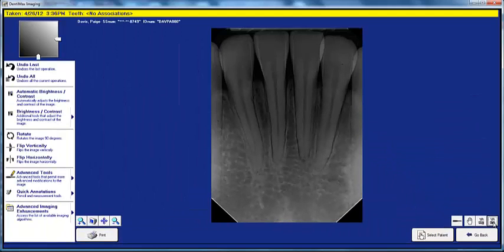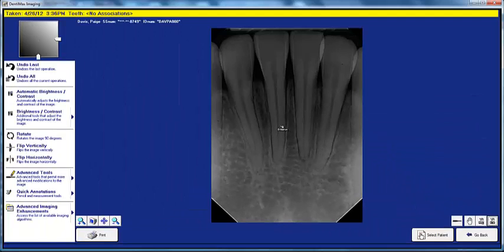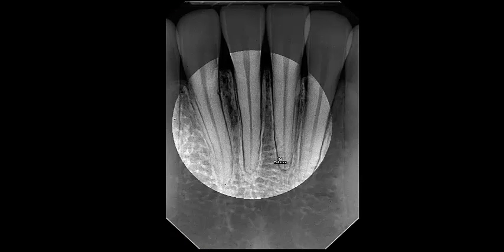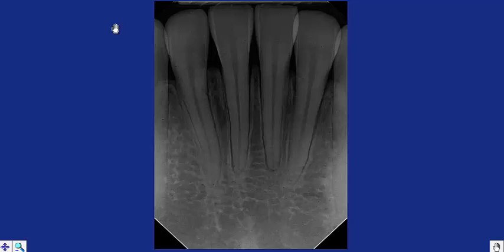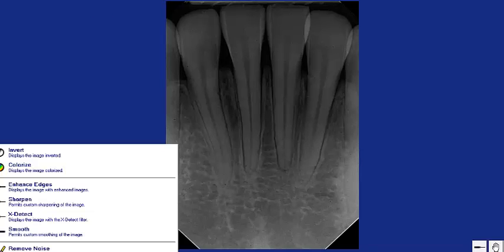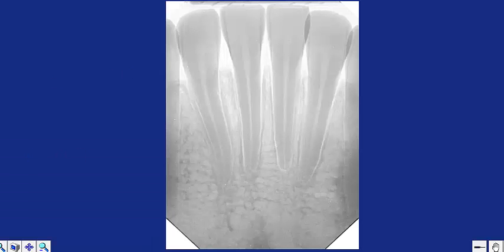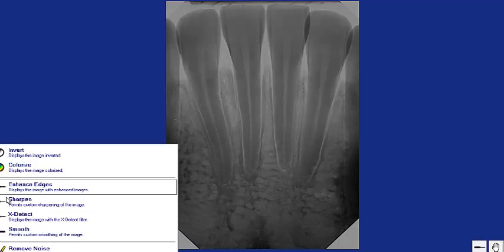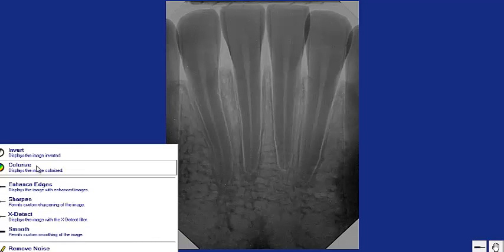Another tool commonly used in dental offices is the Enhancement button, also in the bottom right-hand corner of your screen. Left-click with your mouse and then right-click. This tool uses an algorithm that really brings out the contrast of an x-ray — in this case, it gives the root canal a nice pop. You can go into the Enhancements button and Advanced Tools for additional options, including inverting colors for the entire image, sharpening your images, and colorizing your images.